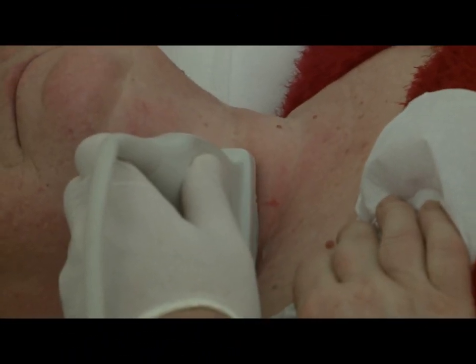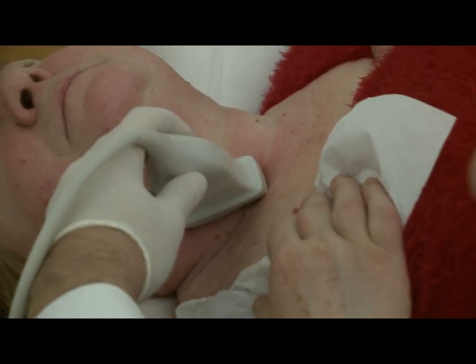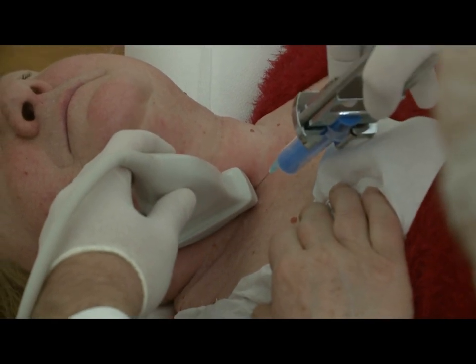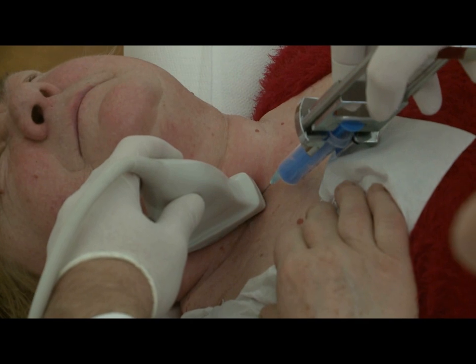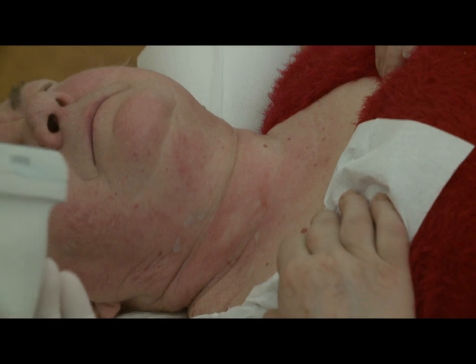Let's see the execution of the other technique — the parallel technique. First, we place the probe on the neck of the patient and search for the adequate position for aspiration. We place the needle in the middle of one end of the long axis of the probe. During the aspiration, the needle advances along the long axis of the transducer. When the tip of the needle is in the right position, we perform the aspiration. The procedure is followed by the preparation of the smear.